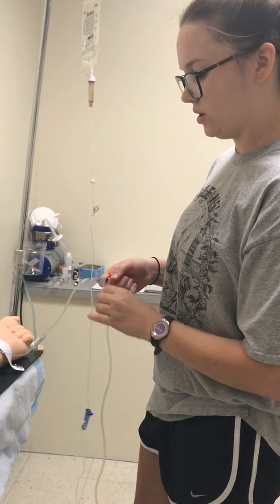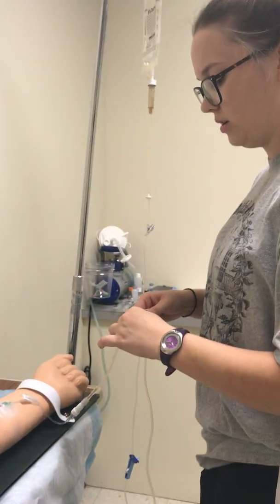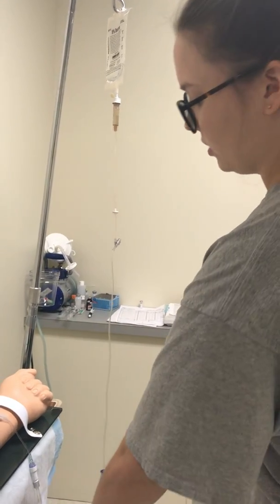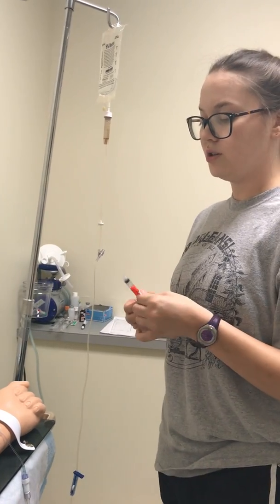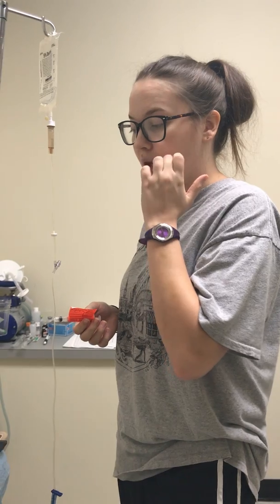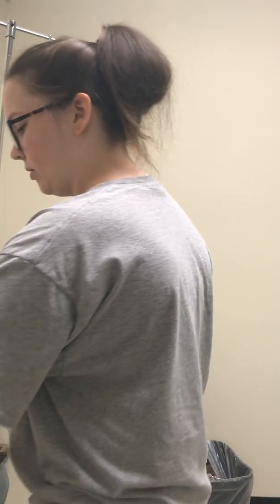Make sure that the patient has tolerated it well. There's no swelling, no redness. Just gonna put that back down. Seems that the patient has tolerated it well. I'll come back and assess in like 10 minutes to check the pain, see if the medication has worked correctly, and I will go ahead and get rid of all my sharps.